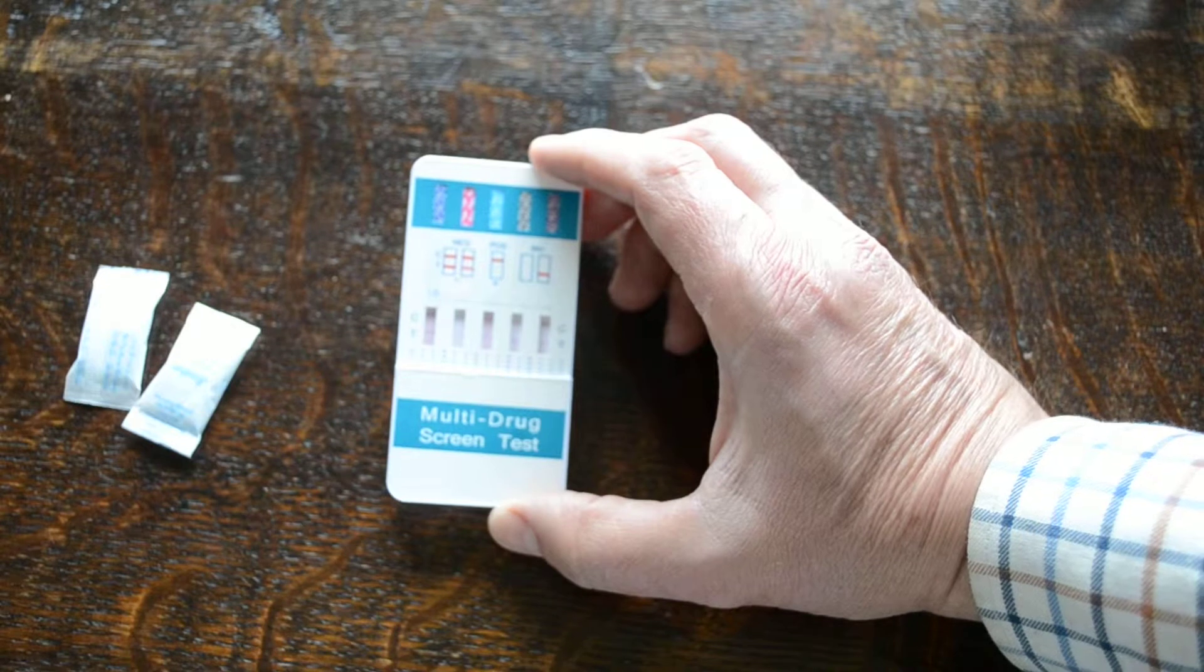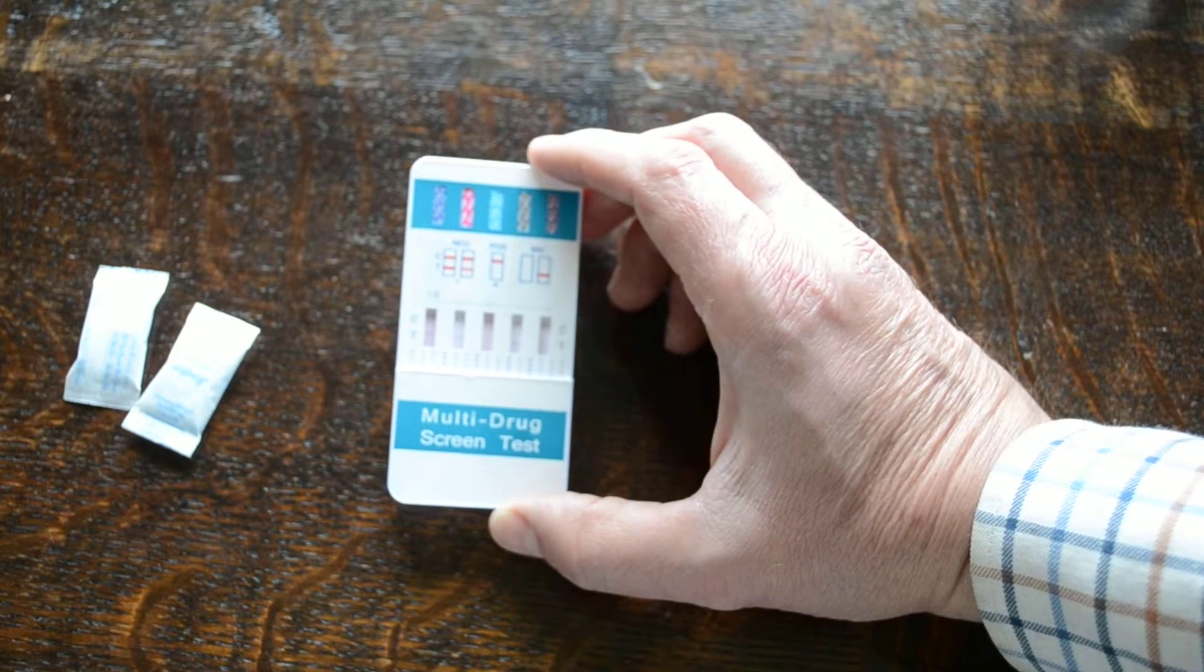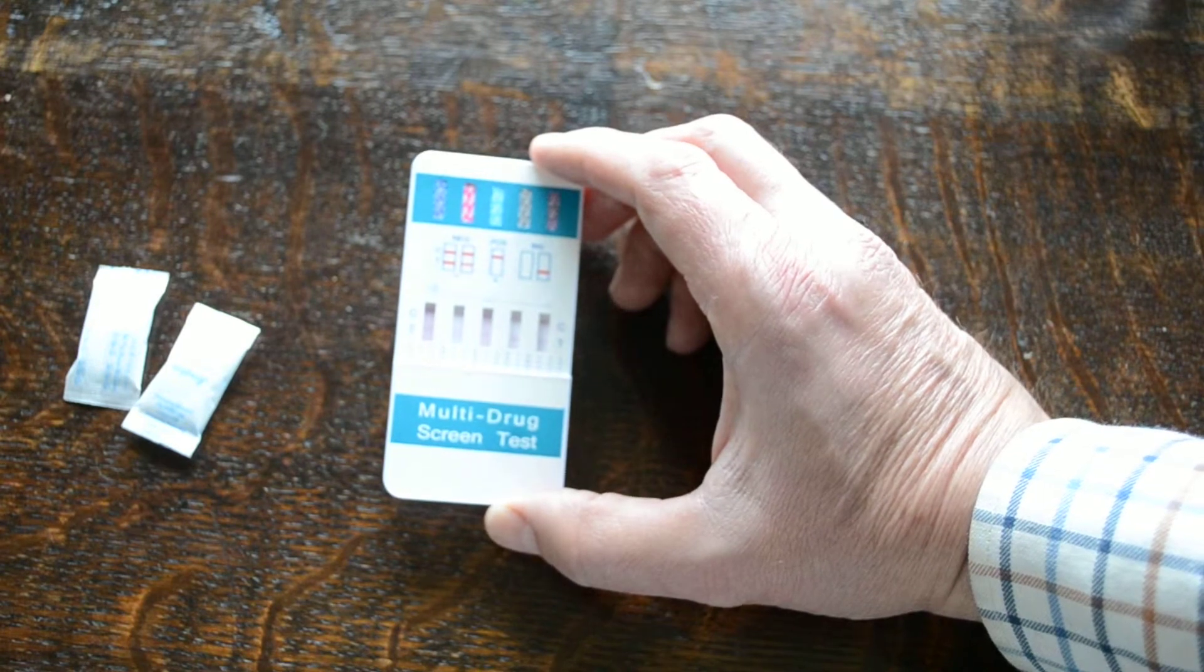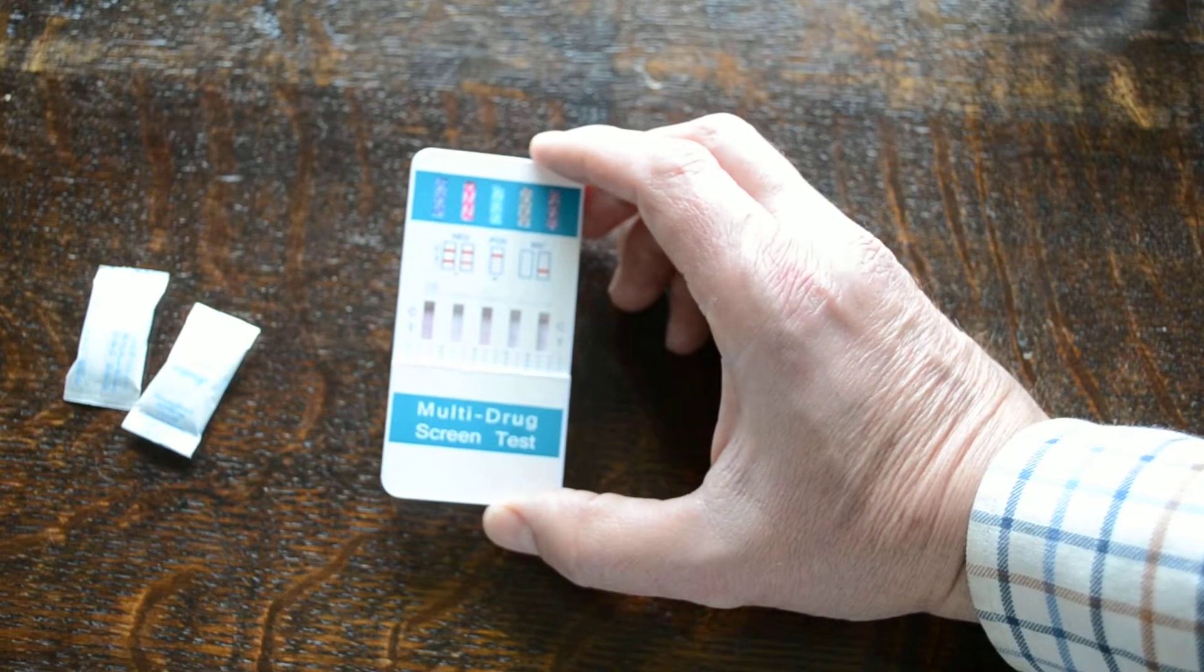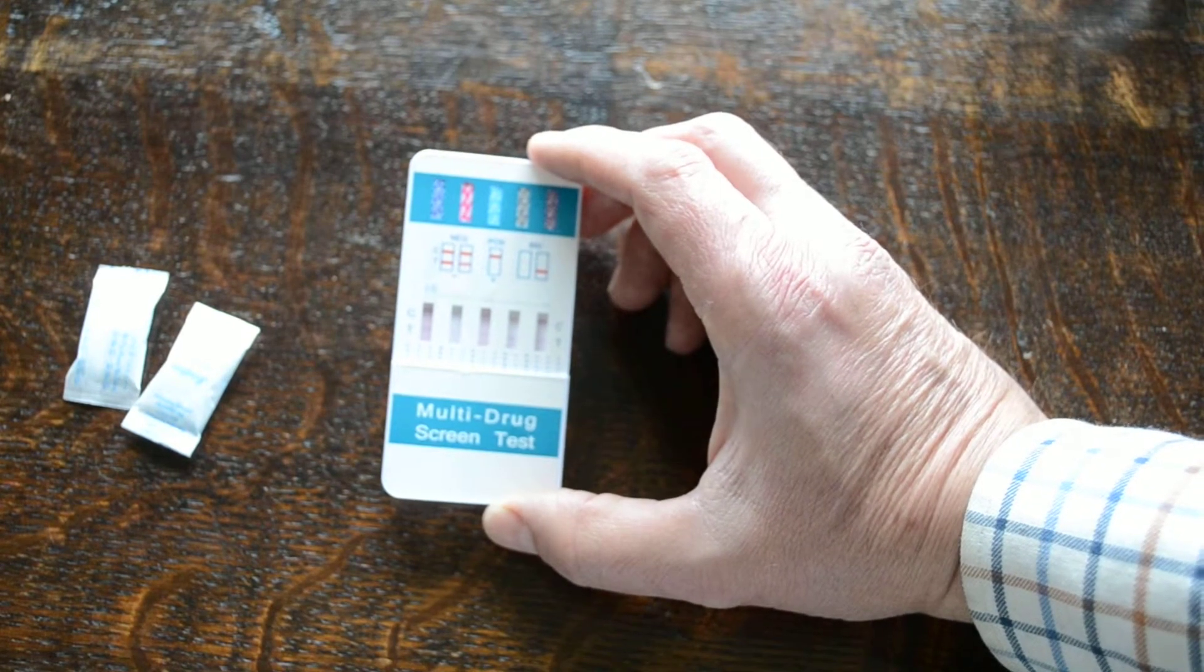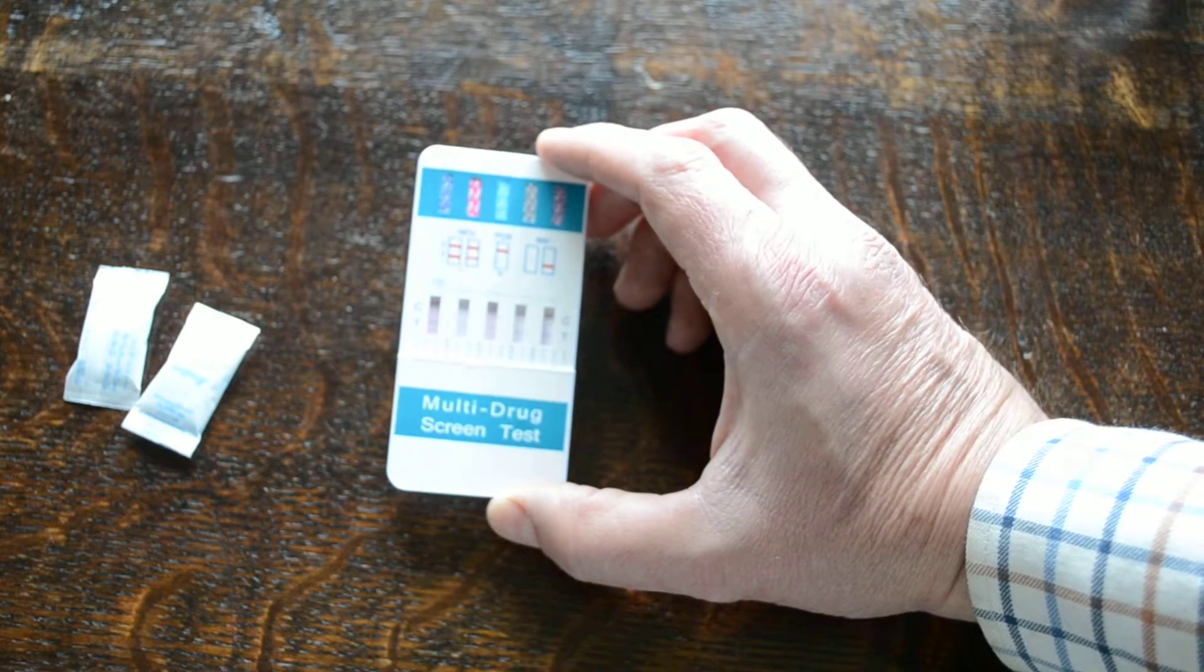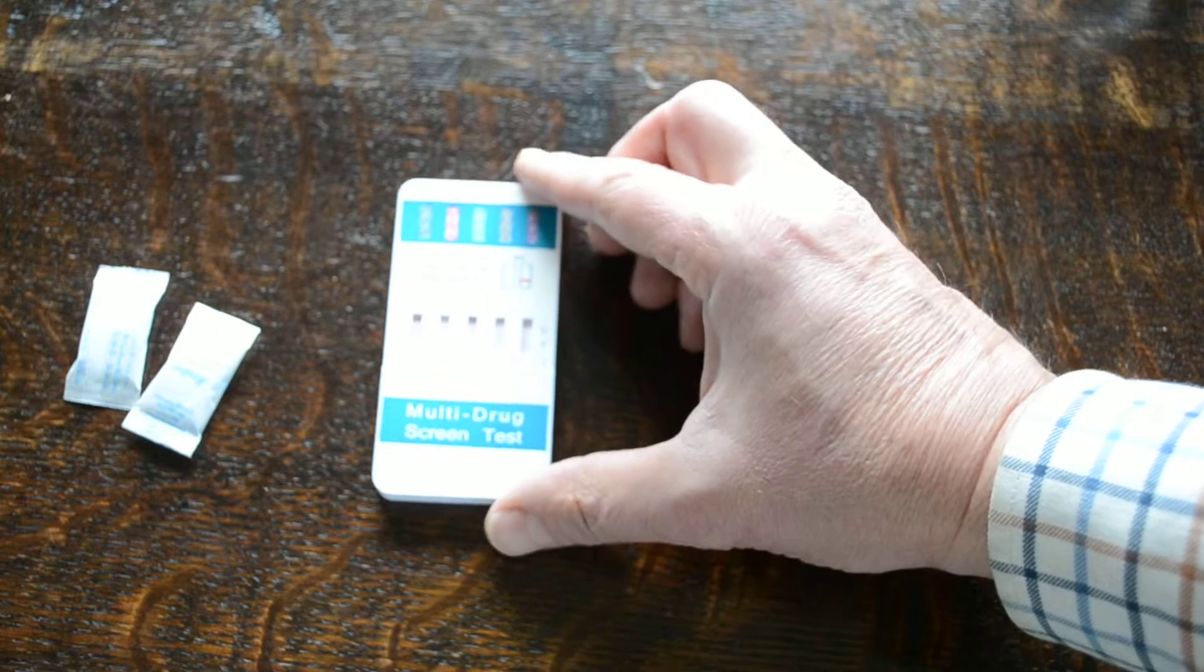Now it's a competitive binding technology, so basically if there's no drug in the system, dye is going to bind at the test line. So you're getting two lines for a negative result and a control line with no test line showing at the indicative period for this test, indicating a positive result.